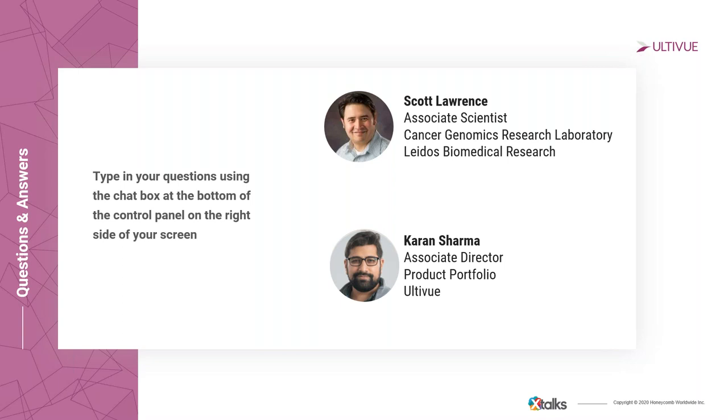And then the second question was asking, can you increase the level of plex by introducing a level of spectral unmixing? Yeah, absolutely. It's not something that we do or is in our pipeline to do, but I'm assuming you're thinking of either something on the Polaris, which right now the limit is, I believe, 8-plex, 9-color, or an instrument out there that could add more dyes and mix across them. I personally think theoretically it could be possible. The reason we don't want to get into spectral unmixing is because we just want to capture all the data, and we don't want to do any kind of data manipulation by removing what biology might be missed if we do add in that unmixing approach.